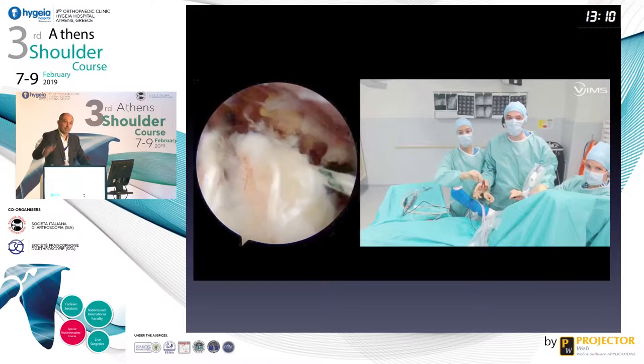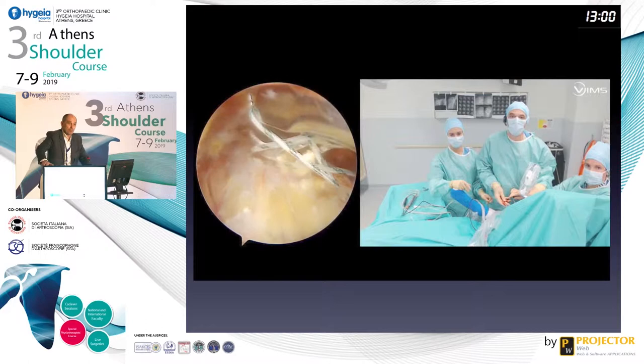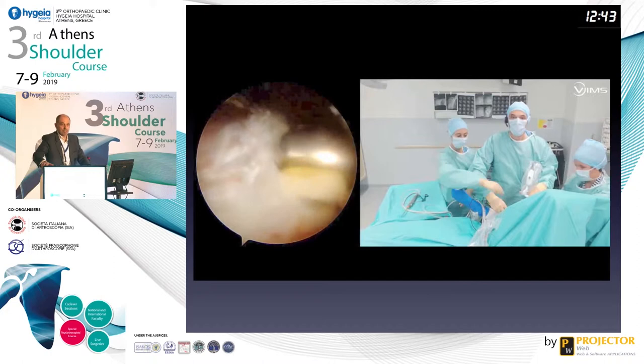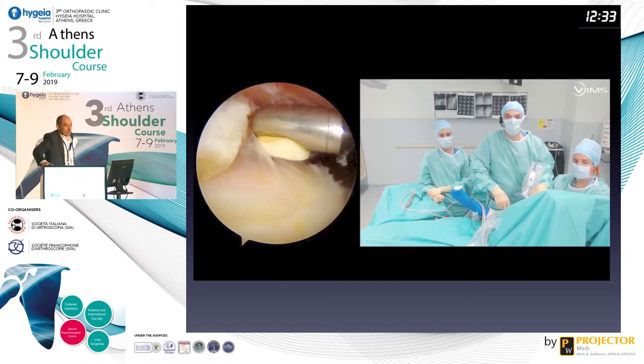Because of that, I have to harvest both the distal edge of the lat dorsi and afterwards the proximal edge. And you can see with this green suture, we are still at the distal part of the tendon, but this time in real life, you need about 20 minutes just for that. But really, it is the main point and the most demanding point. So now, after that, you continue the tenotomy of the lat dorsi, which is there, and don't cut in that indication.